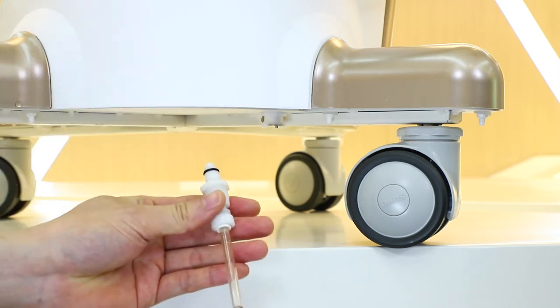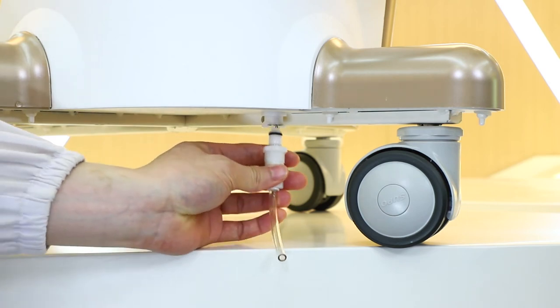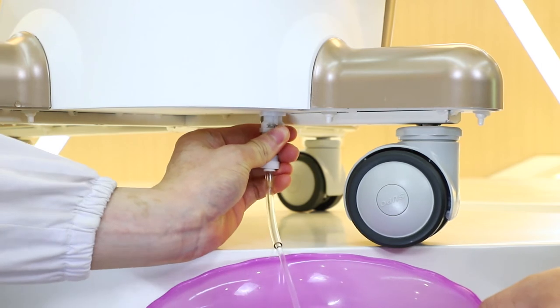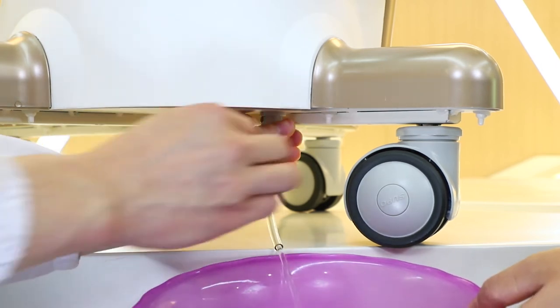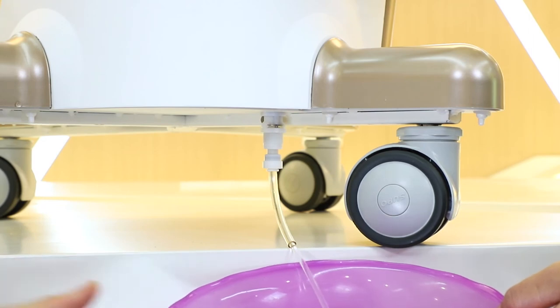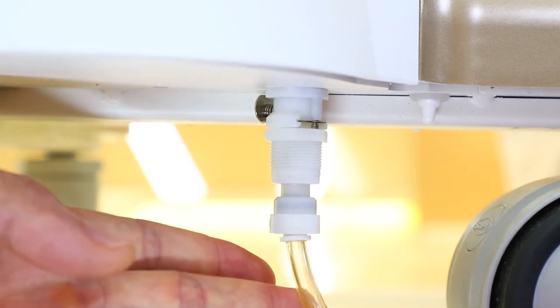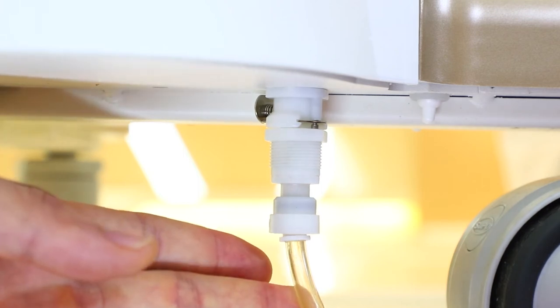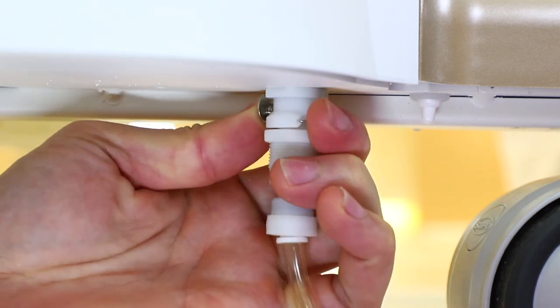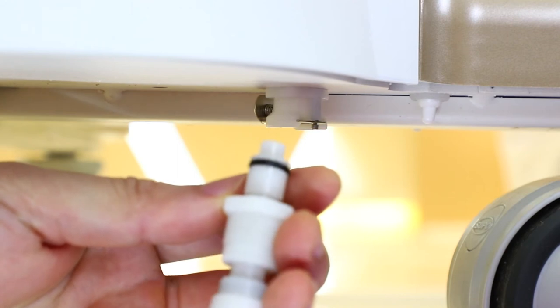Then we fetch a water outlet pipe and install it to the machine, so water will come out. When there is no water coming out, we need to take off the water pipe. All we need to do is press the spring in the connector, so the water outlet pipe will be uninstalled.